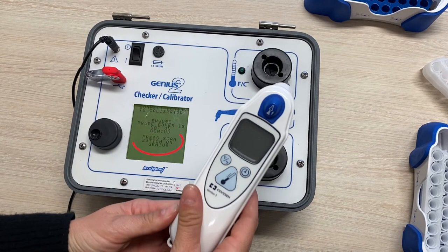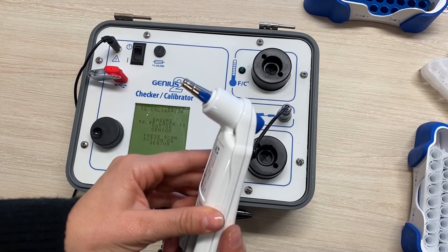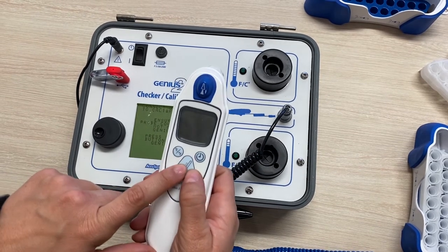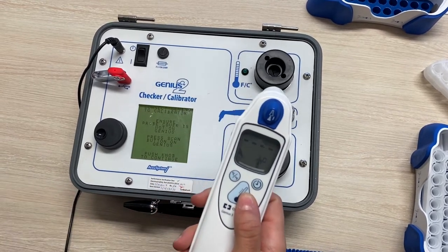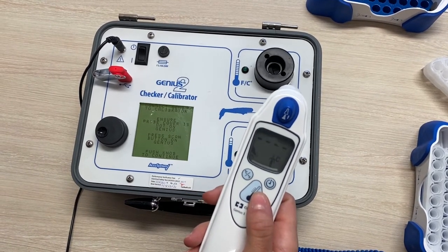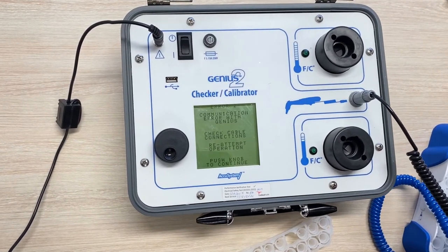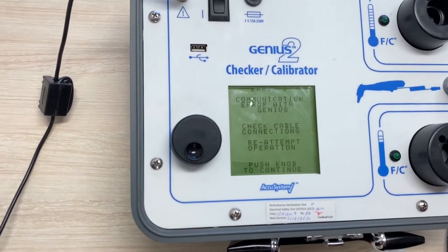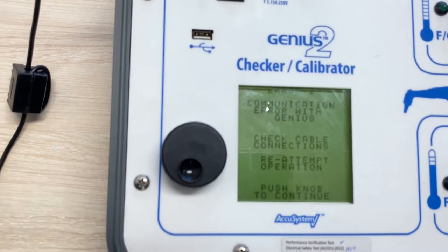Then you'll be directed to press the scan button on the thermometer, which will power on the thermometer before a probe cover is loaded onto the probe tip. Make sure you don't add a probe cover beforehand. Normally after you press the scan button, wait about three seconds before pressing to continue. If you press continue too quickly, the calibrator doesn't have enough time to establish communications with the thermometer and you will get a communication error, which is error 2.